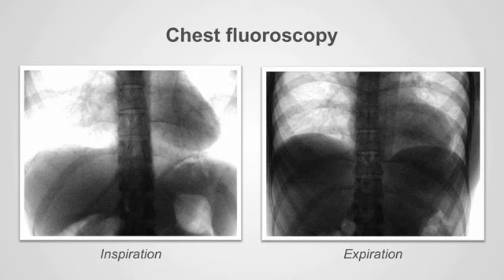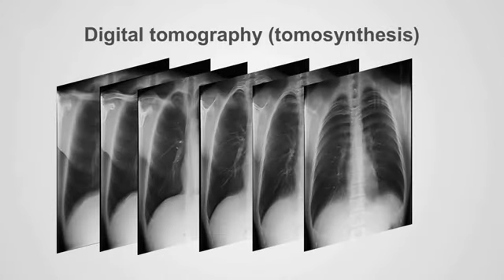this technology. Digital tomography is a technology that with post-processing, an X-ray image can be subdivided into various layers very similar to a CT examination, thereby also eliminating the issues of overlap and hiding of structures because of overlap.